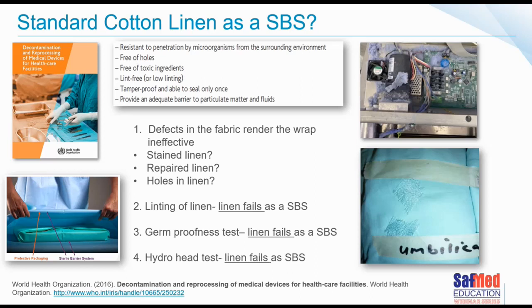It just refers to the process of manufacturing sterilization barrier material that's primarily made of cellulose paper, but they have certain additives to it to improve its repellency and drapeability. So it's the addition of the various items, and I think Zana talks about it a little bit. It's the addition of those items, so they call it a wet laid process. Thank you, Roger.